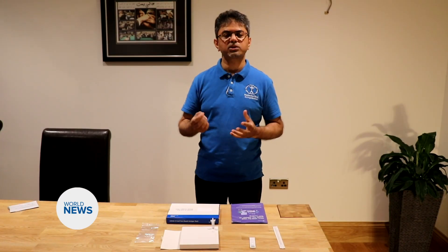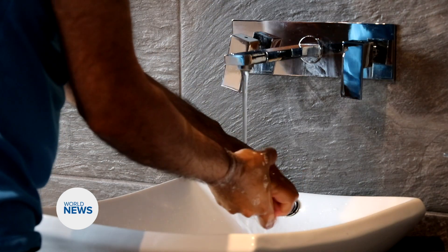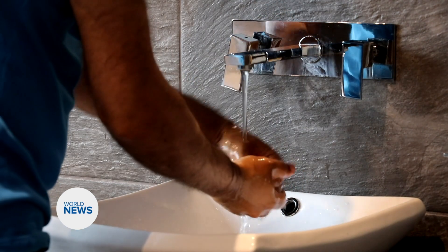Now before we actually take the swab we need to blow our nose. We now have to wash our hands again, for 20 seconds with warm soapy water.